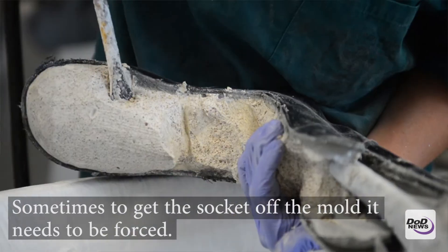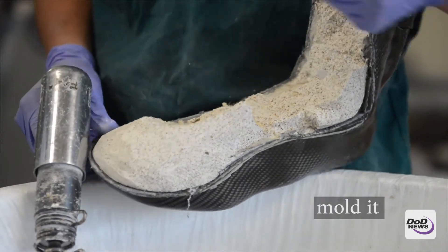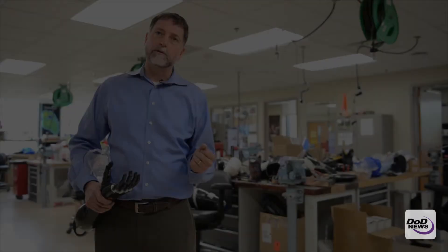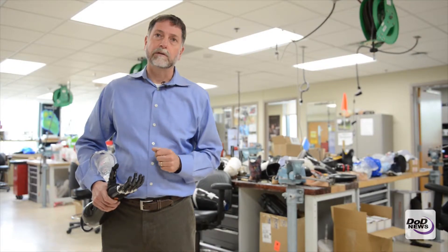Sometimes we have to break out the plaster of Paris before we can get to the socket by itself, and then from there we'll take that socket and attach different components to it after they've trimmed it up back in the sanding room.